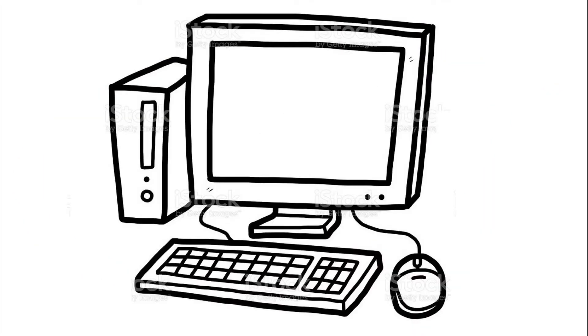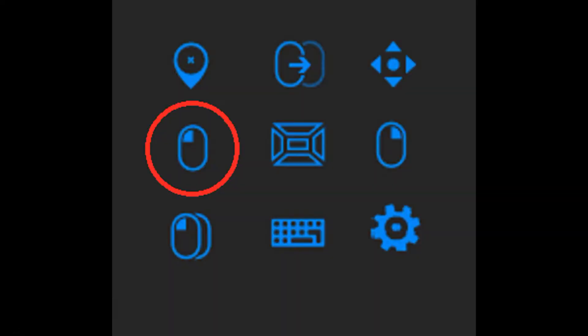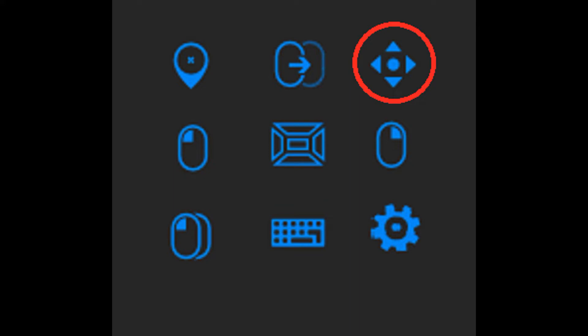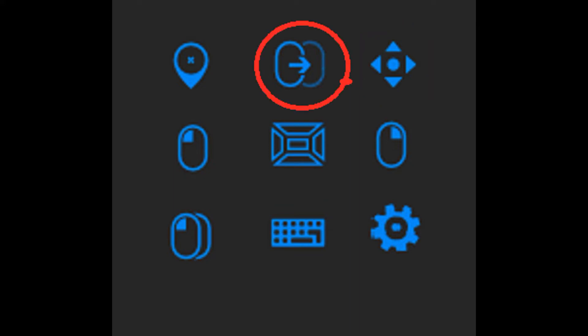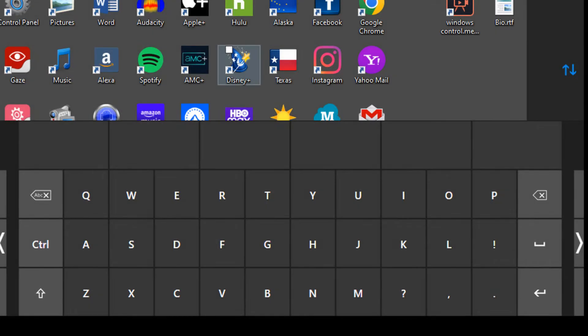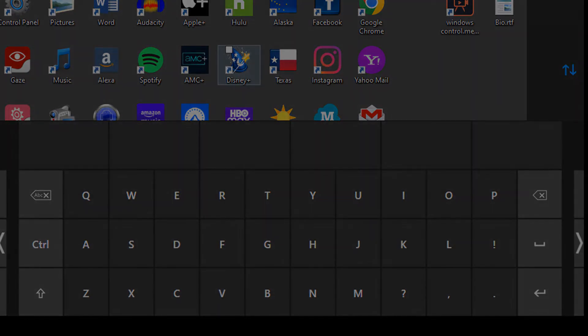It has all the functions of a computer mouse: left click, right click, scroll, click and drag, and double click. It also has a customizable keyboard and a few other features as well.